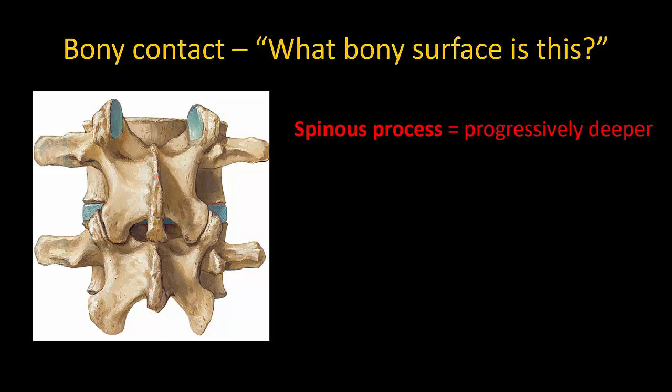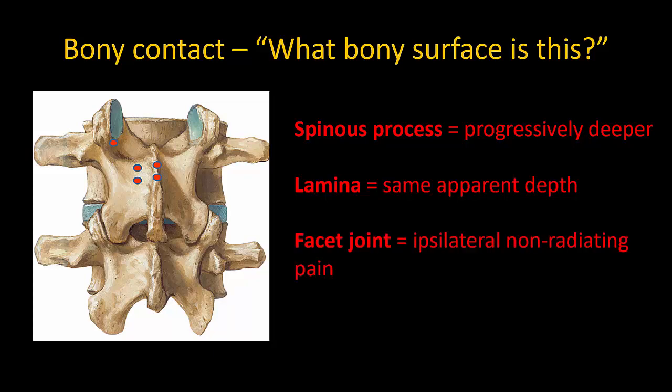If you are on the spinous process, cranial angulation should take you progressively deeper. If you are off the midline and walking up the lamina, it will feel like you are striking bone at the same depth each time. If you are very far off the midline, you may strike the facet joint, which will elicit pain on that ipsilateral side.